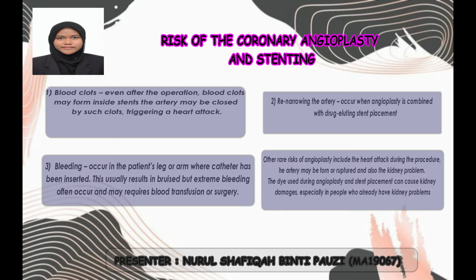The most common angioplasty risk is blood clots. Even after the operation, a blood clot may form inside the stent. The artery may be closed by such a clot, triggering a heart attack. And second, the most common risk is renarrowing of the artery. There is a small risk that the treated artery may become clogged again when angioplasty is combined with drug-eluting stent placement. And third, bleeding.